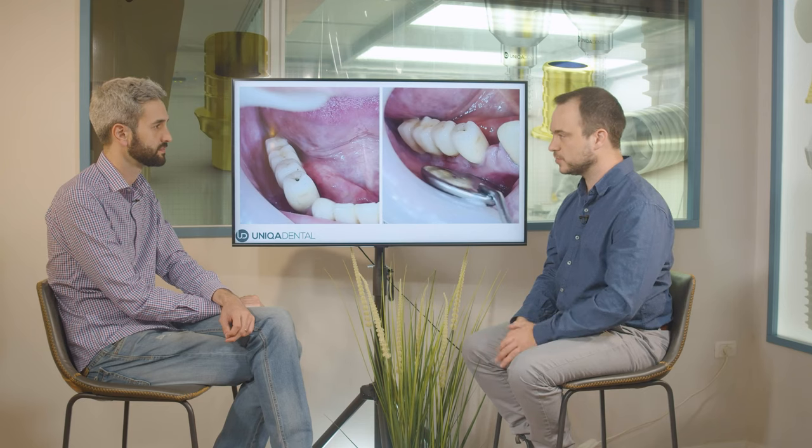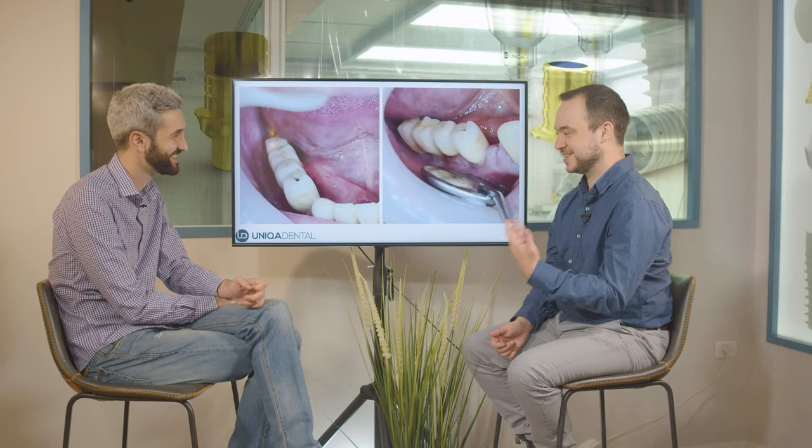And in the meanwhile, we'll change it from a cemented to a screw-retained restoration. This way we can add another crown without any bone augmentation, without any difficult procedures — without adding another implant.